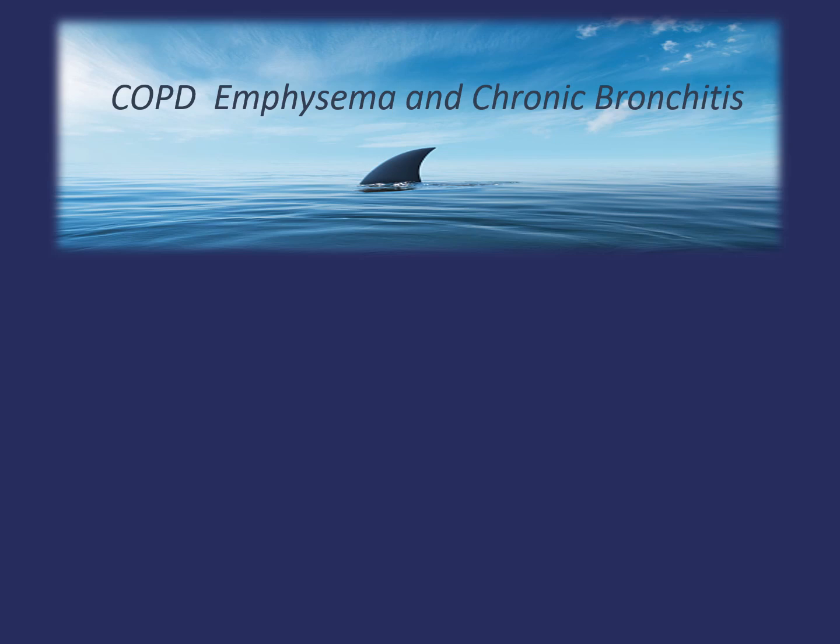When we talk about our COPD patients, emphysema, or chronic bronchitis patients, these patients all suffer from chronic CO2 retention, which results in higher end-tidal CO2 quantities than that of our asthma patients. As well, their baseline waveform will be of the shark fin variety. COPD exacerbation will consistently present with higher CO2 levels and a shark fin waveform, as long as there's no other compounding factors involved. If you compare that to our asthma patients, who present with a lower end-tidal CO2 initially.